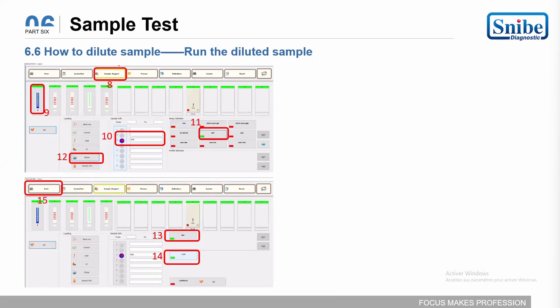After that, how to use the dilution ratio? If I am in the sample and reagent area, I select the rack, select the parameter, select the position, and then click dilute. It will show me the list of dilution ratios to select from. You can see here we have only one. All the dilution ratios for the parameter already defined in the definition will be displayed here, and then you can choose which one to be used.